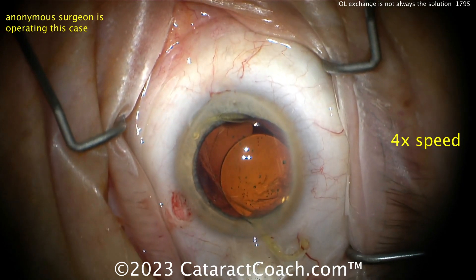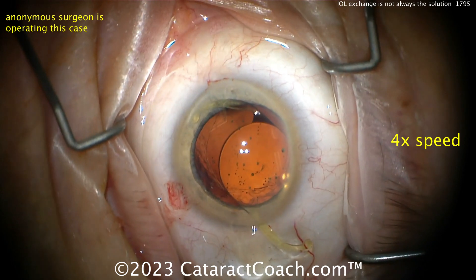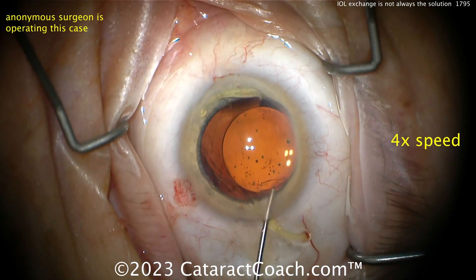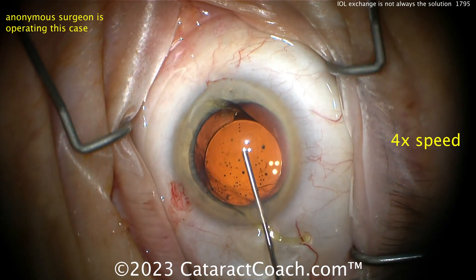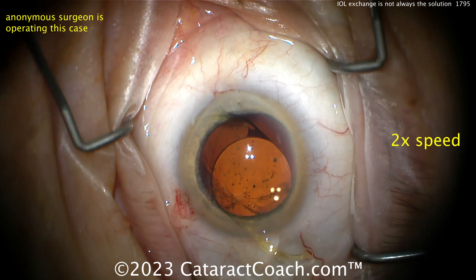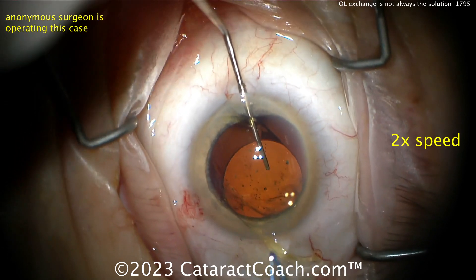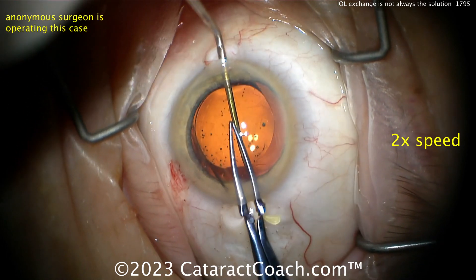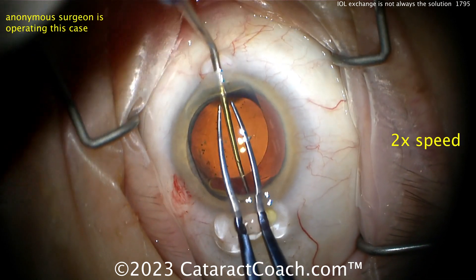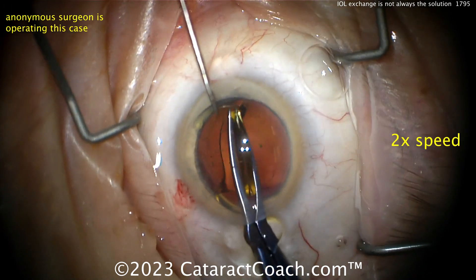Looks like you finally freed it — there it is, it's out of the eye. I would do my twist-and-out technique. Enlarging the incision, more viscoelastic. Here's the technique to explant the lens — twist it. Now there's a spatula going across the eye; we're going to fold it inside the eye. You can refold it using folding forceps. This must be an older surgeon — you've got to be 60 years old to do this.